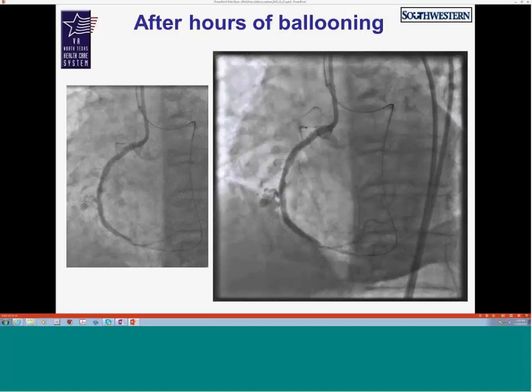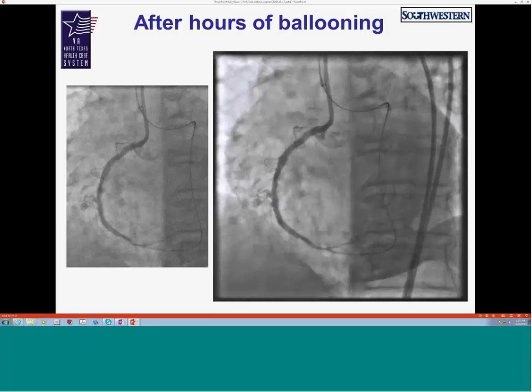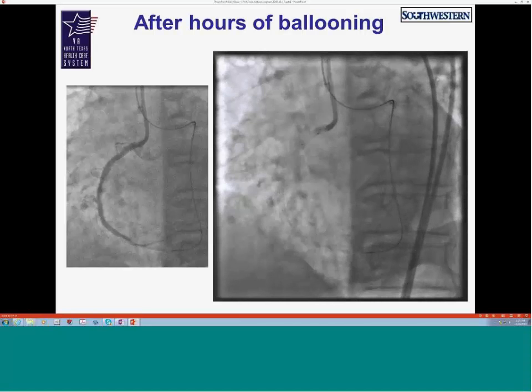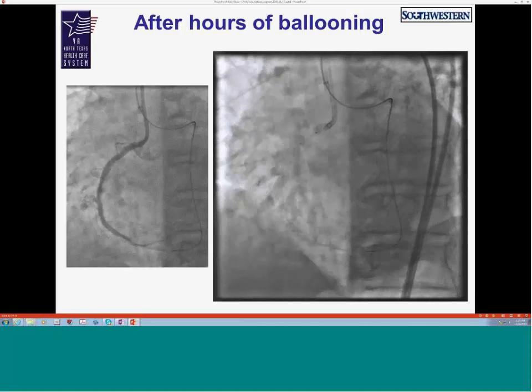There's the other opinion saying that if you do that, you may actually pop open an existing plane and make it worse. Again, in this case, it didn't do better or worse. It just kept on bleeding.